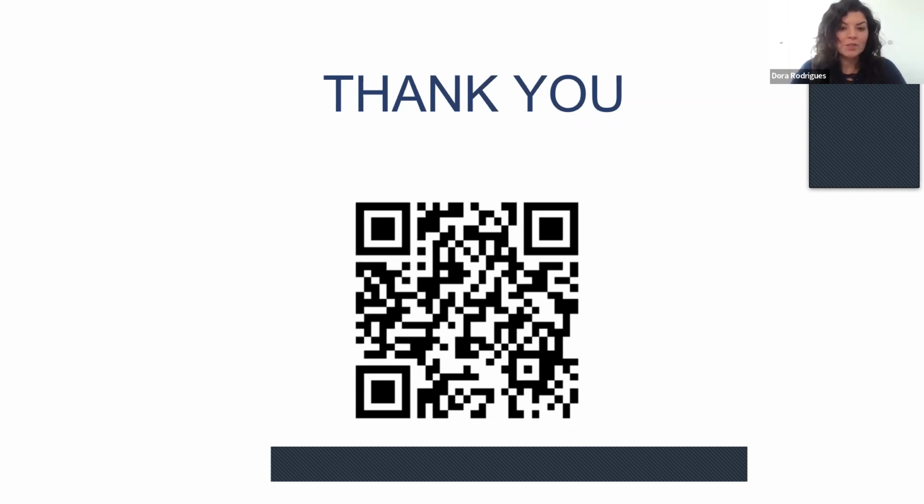So printing dentures is here, and it's here to stay. I would say give it a try. It's fast, it's simple, and you wind up having a happy doctor and a happy patient. And it's super fast. The resin is good. The colors of the teeth and the base are really, really nice too.